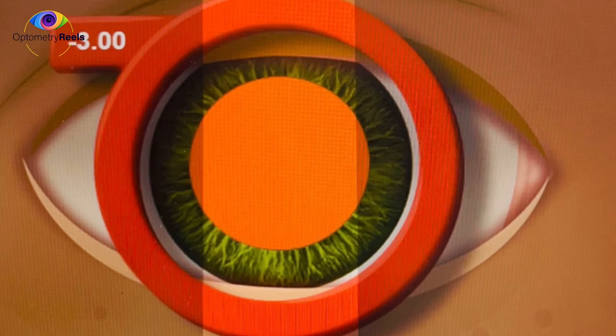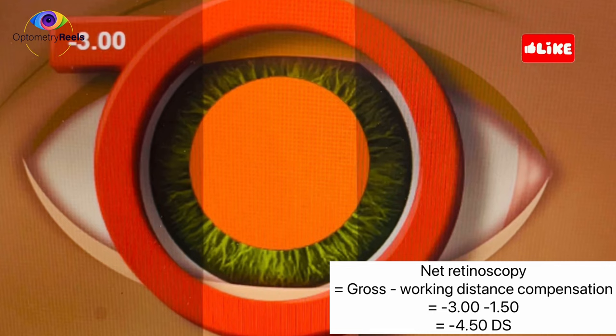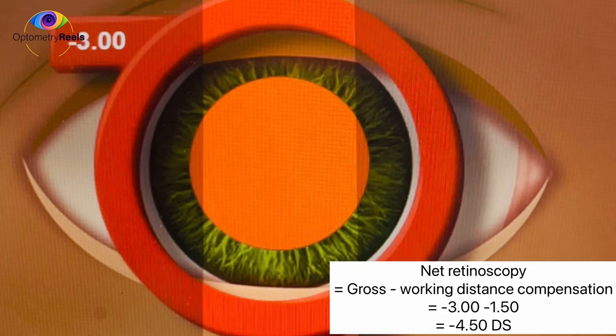Again, to get the net value of the retinoscopy, we compensate for our working distance. My working distance is 67 centimeters, so I deduct minus 1.5 diopters. Minus 3.00 plus minus 1.5 gives a net retinoscopy value of minus 4.50 diopters sphere.